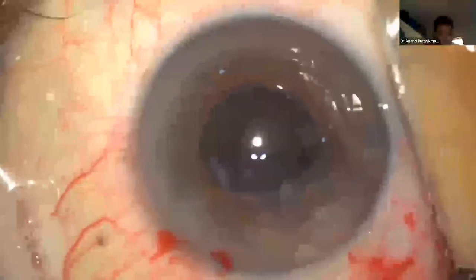Everybody can use this technique for prolapsing the nucleus, especially in these kinds of cataracts where the nucleus is very hard. Even doing phaco is a little difficult, especially if the cornea is compromised. So I find this technique very easy.